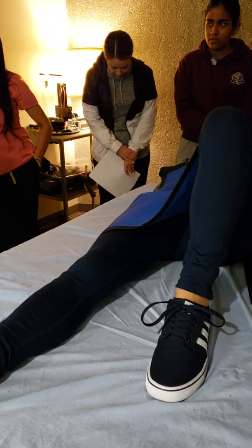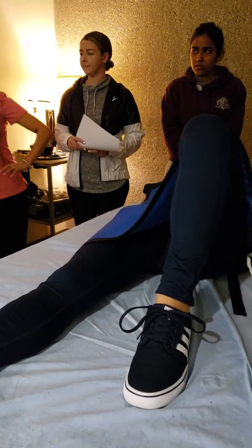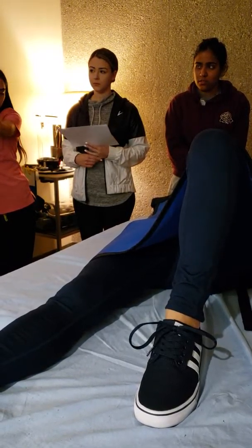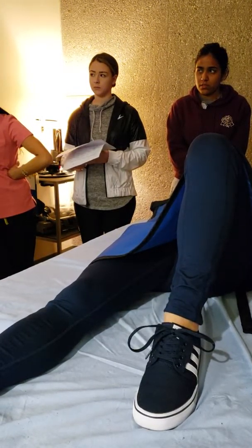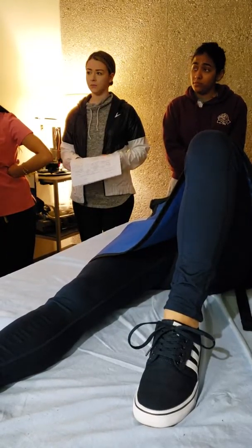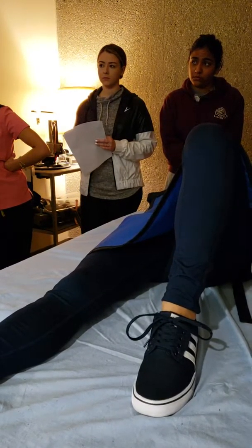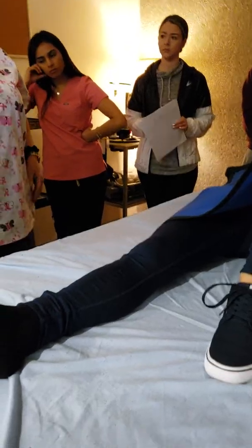You want to think about how your sequencing is going to be comfortable for your patient's positioning. You don't want to keep flipping them around back and forth. Just like if you're doing multiple exams, you would do an AP ankle, an AP tib-fib, AP knee, and then do your laterals. It's not by body exam, it's by the part that's comfortable for the patient. So right now you're just learning the exams, but eventually that's part of your critical thinking — how to sequence it so you can get everything done for the patient's comfort.